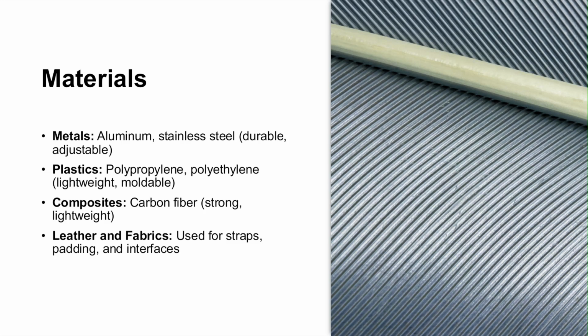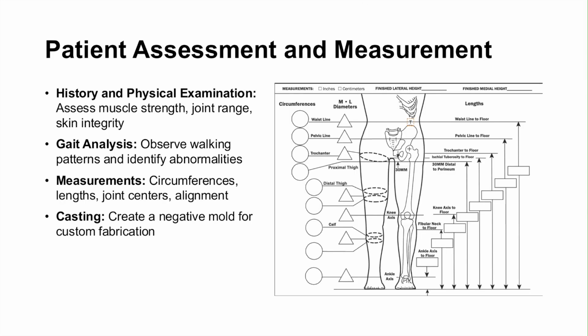Patient assessment and measurement before anything is built. A comprehensive assessment is key. Now this is the process of fabrication. We have several processes, which include casting and positive model creation.